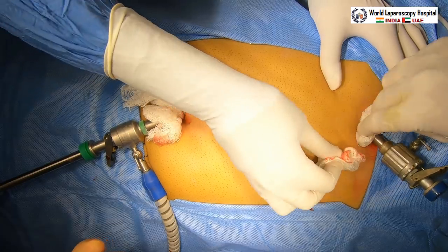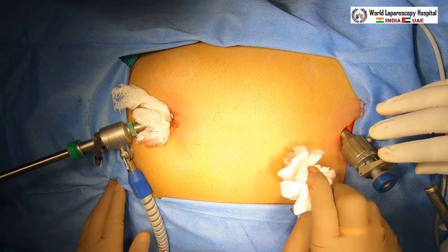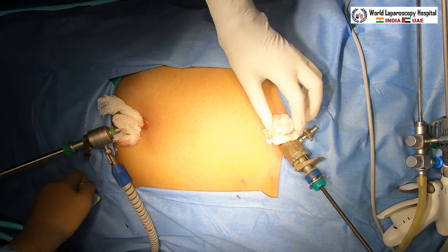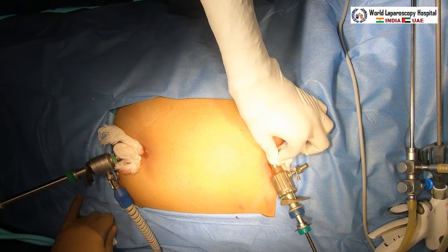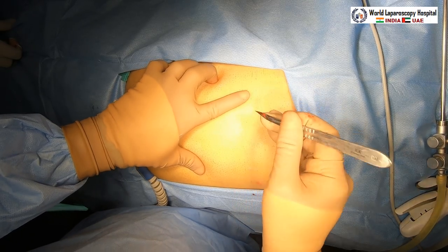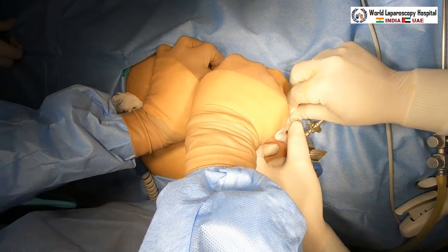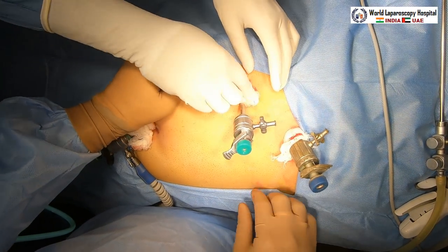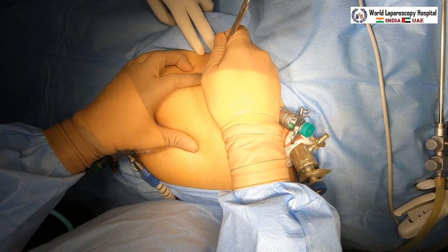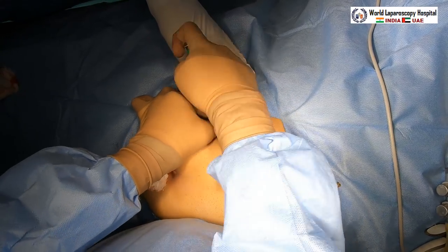The third port is introduced at the mid-clavicular line, just below the fundus of the gallbladder or below the costal margin. The epigastric port is your right-hand port; perform initial diagnostic laparoscopy and slowly tilt the patient head-up and right-up. The anesthetist can adjust the table remotely. The third port at mid-clavicular line will be your left-hand instrument. The fourth port is placed 7.5 cm lateral and 7.5 cm below in the anterior axillary line — this port is for the fundus grasper.